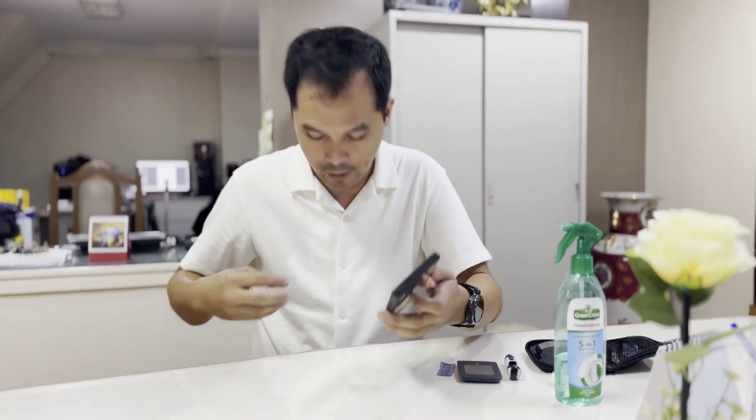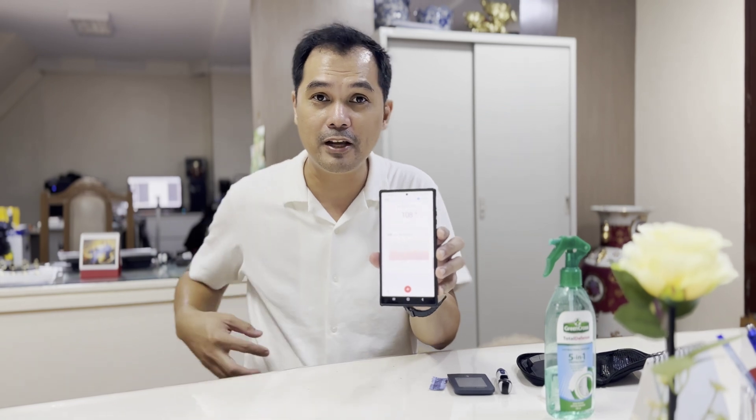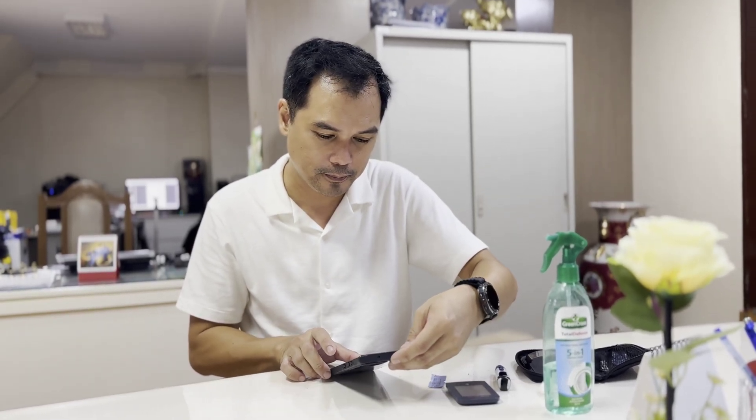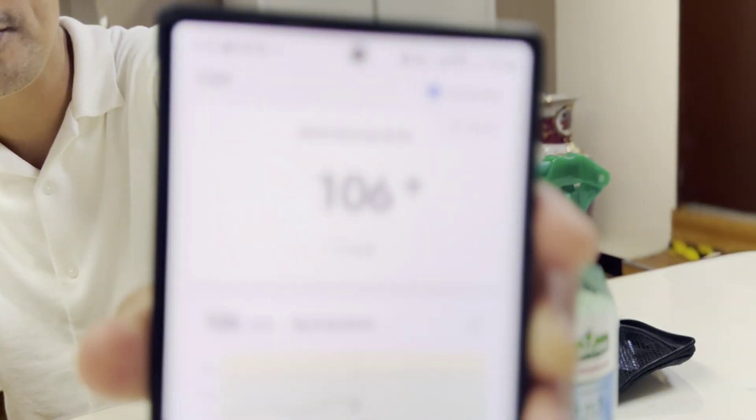Okay guys, the sensor warming up is already done. The sensor and the app have been running for around seven hours already. The sensor measures glucose level every three minutes. So what we're going to do now is compare the measurements from the SinoCare device with the traditional glucose meter. The latest measurement from the app at 6:58 PM is 106.